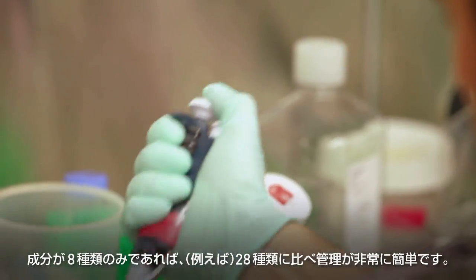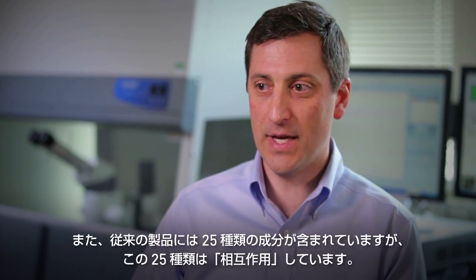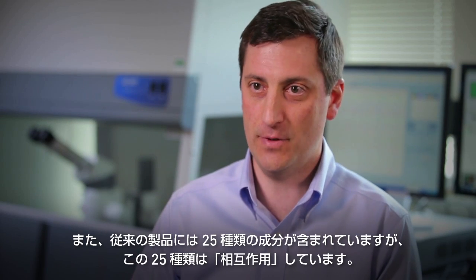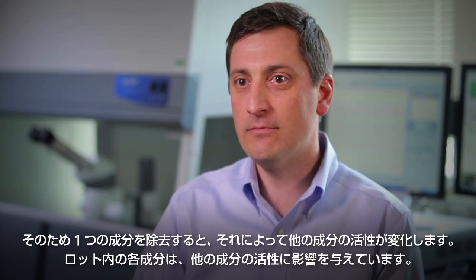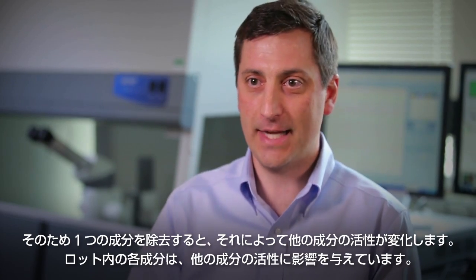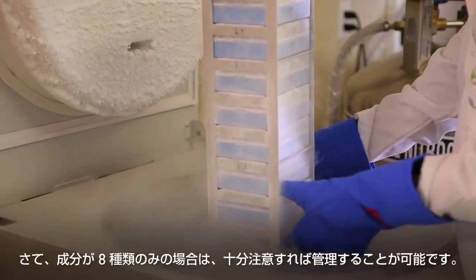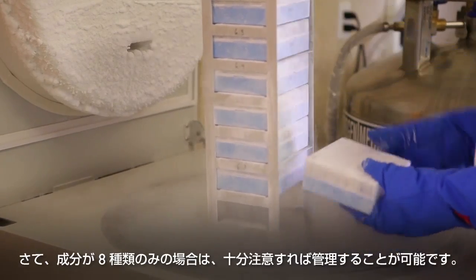You can control something that's 8. It's very difficult to control something when it's 28. The other thing about stem cell media is it's not 25 components, it's 25 interactive components. If you delete one component, it affects the activity of others. The lot of one component affects the lot activity of another. Now that there's only 8, you can work really hard to control them.